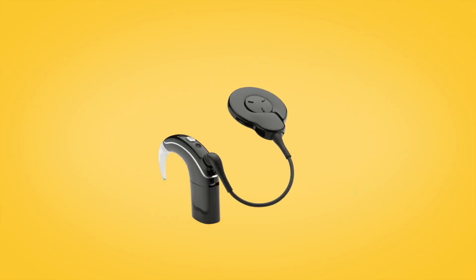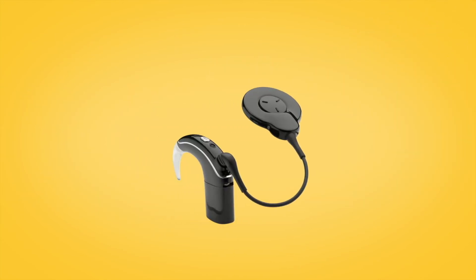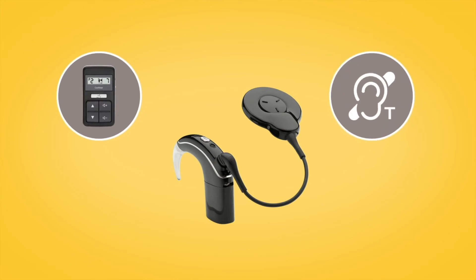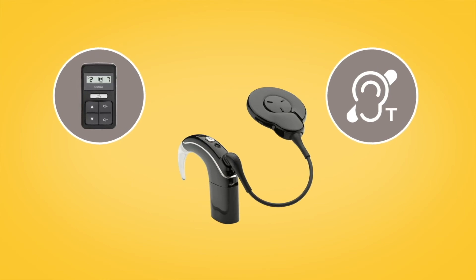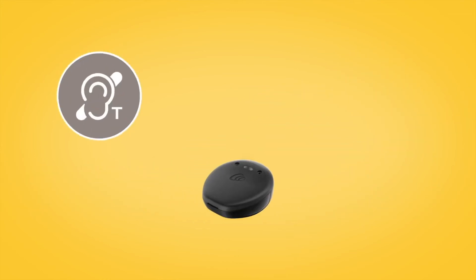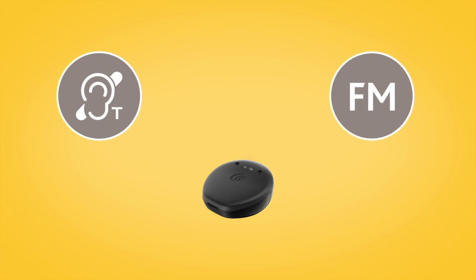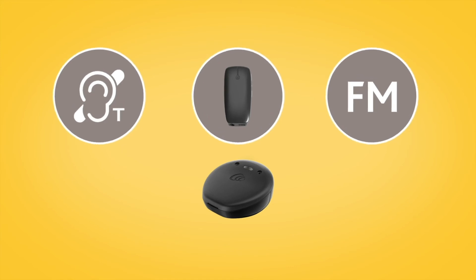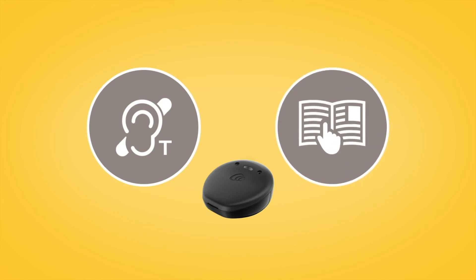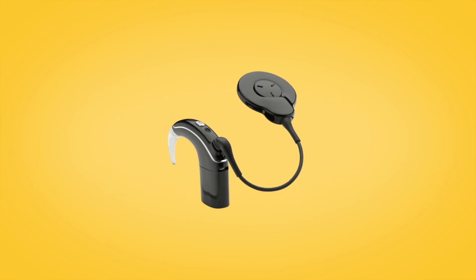If you have a Nucleus 7 sound processor, you can also use the remote control to turn on your sound processor's built-in telecoil. If you have a Kanso 2 sound processor, you can access telecoil and FM functionality via the Mini Microphone 2 Plus. For more information about using telecoil with the Kanso 2 sound processor, refer to your true wireless devices user guide.